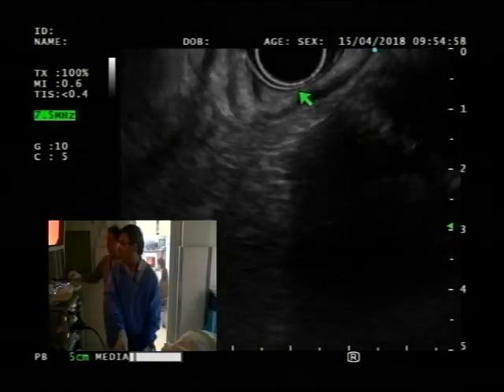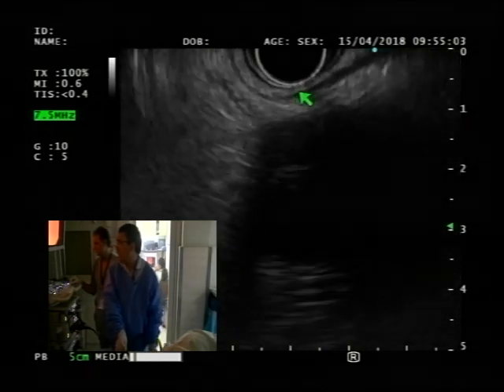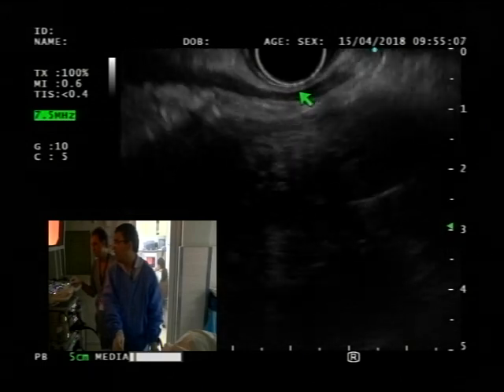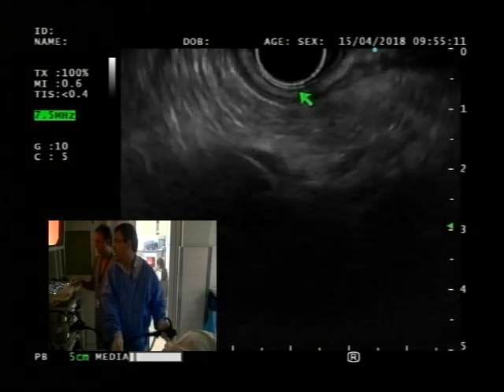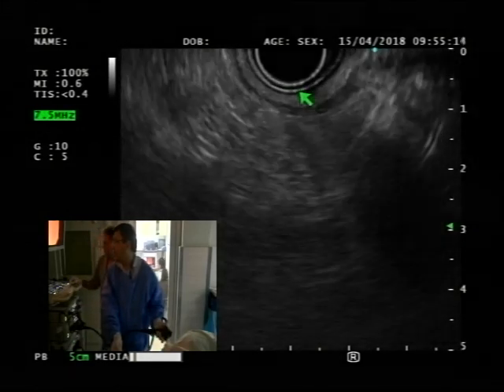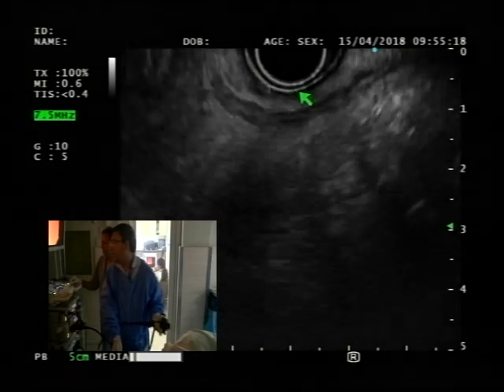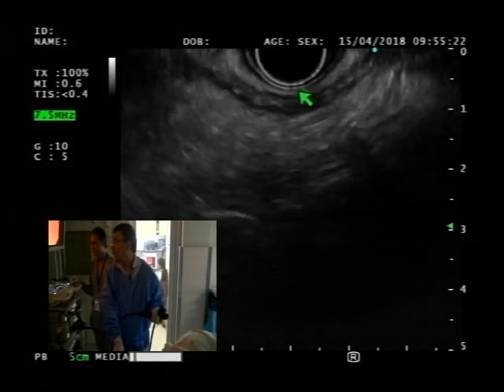So the bladder comes again. And they said it was an anterior wall before, so this would be the anterior, right above the bladder. So I can keep pulling the scope back. Don't see anything there either. Okay. Right here maybe. So here, I don't see any tumor there.